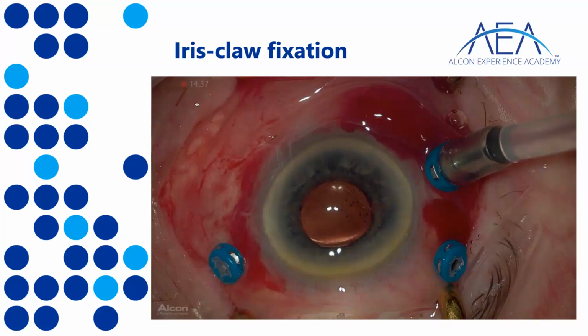The results are amazing. I have implanted, I don't know, 200-300 of these iris fixated IOLs. Results are very, very good, and complications are very, very few. We have probably 10% of CMO, which invariably resolves with a little bit of treatment.